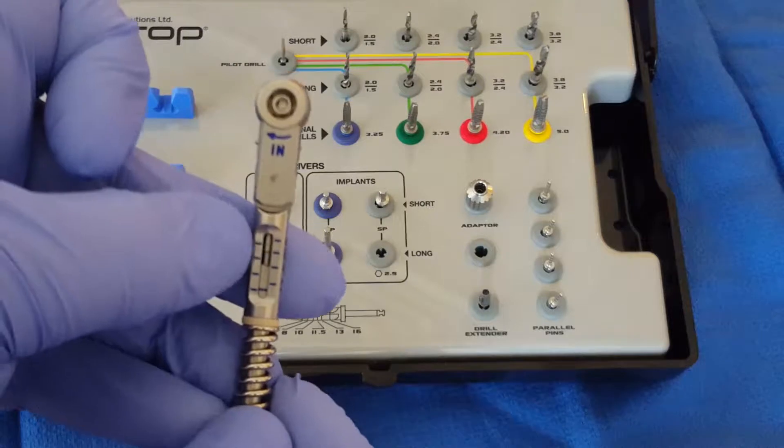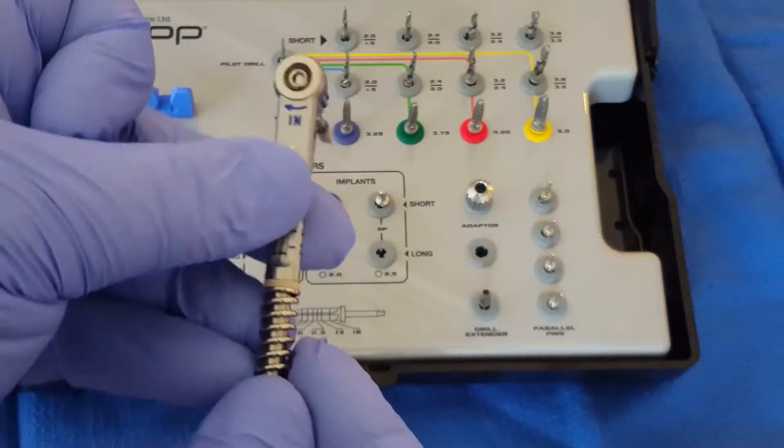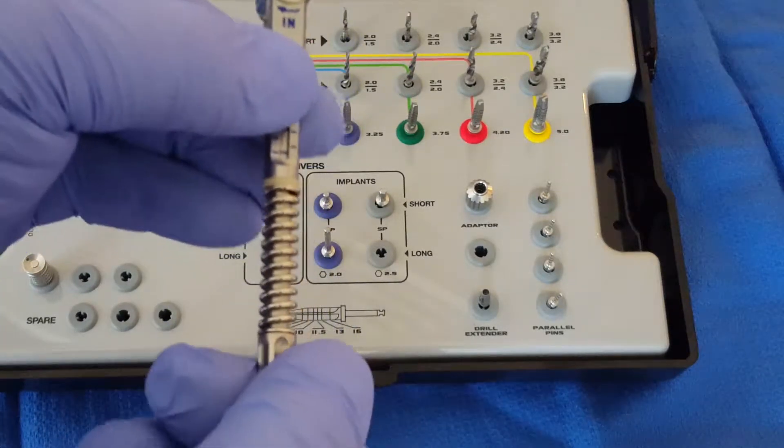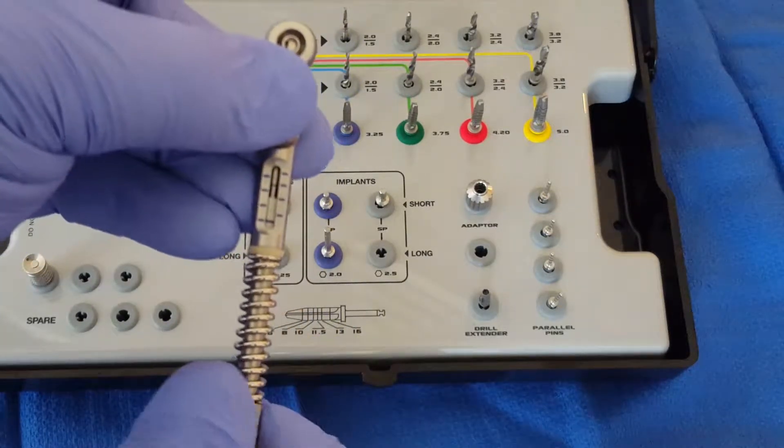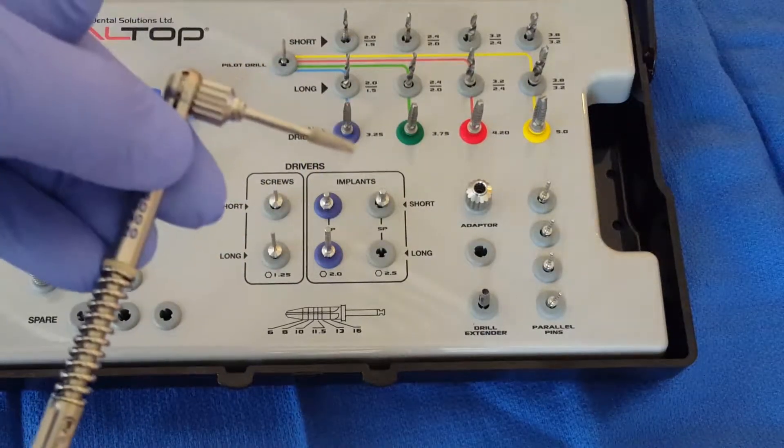We can even control the torque by adjusting the torque setting on the driver, and that's by twisting the handle. We can go ahead and set the torque driver. Everything fits securely in place, nothing is going to fall.